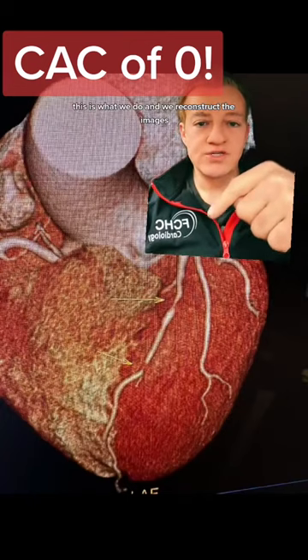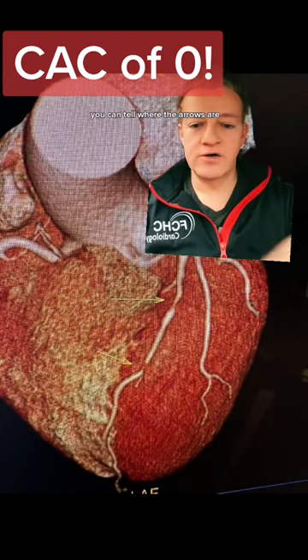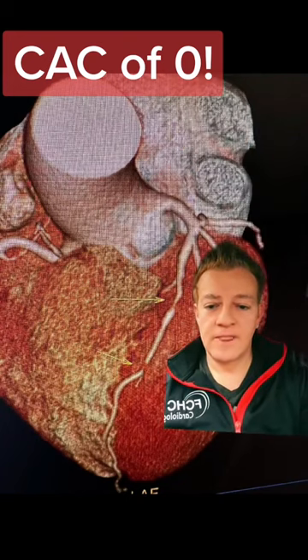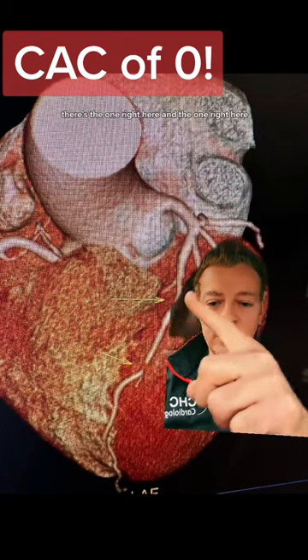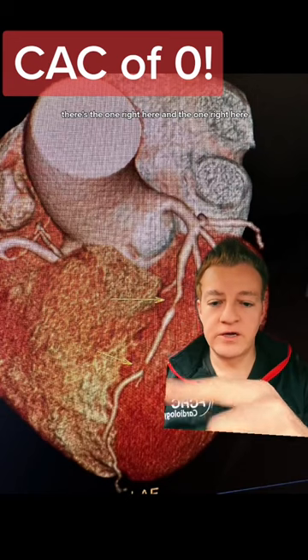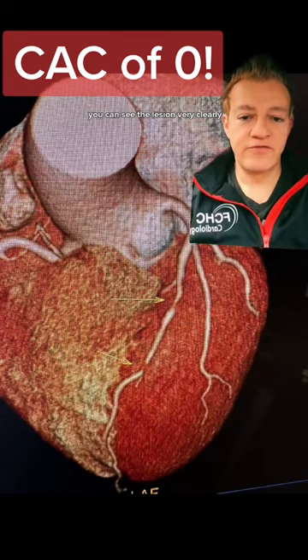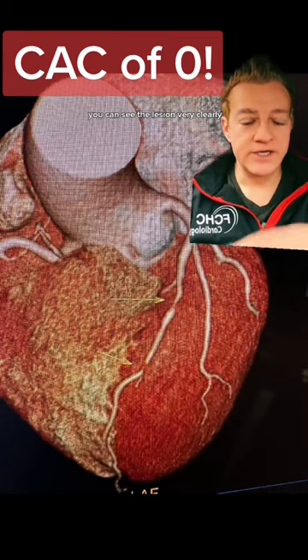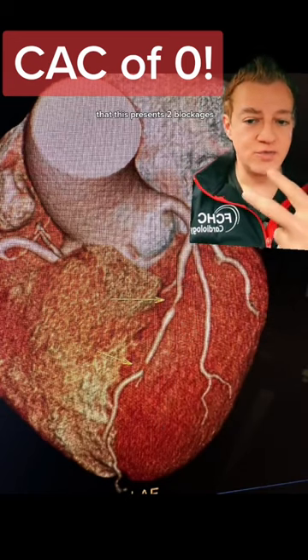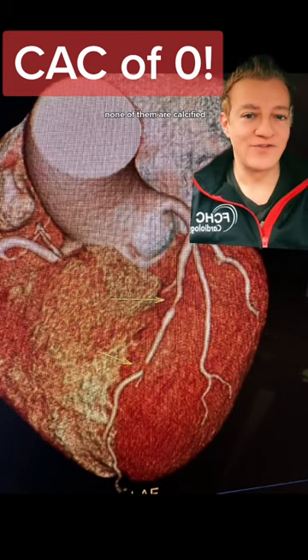This is what we do — we reconstruct the images. You can tell where the arrows are. There's one right here and one right here. You can see the lesions very clearly: this person has two blockages, and none of them are calcified.